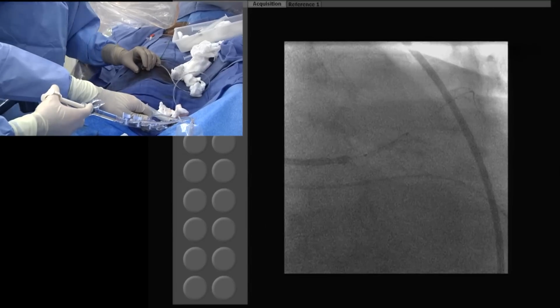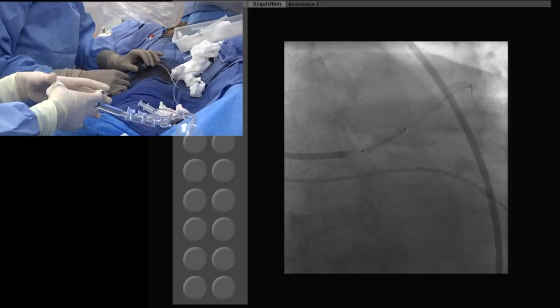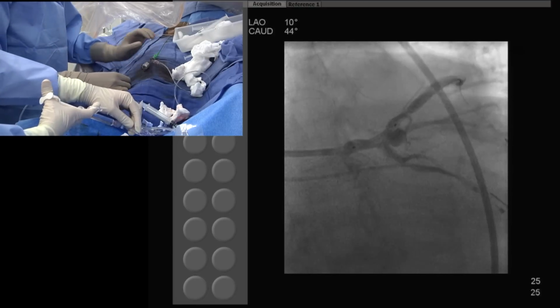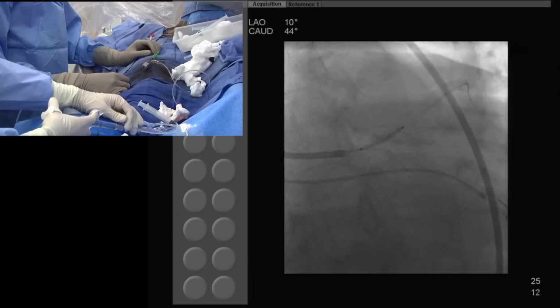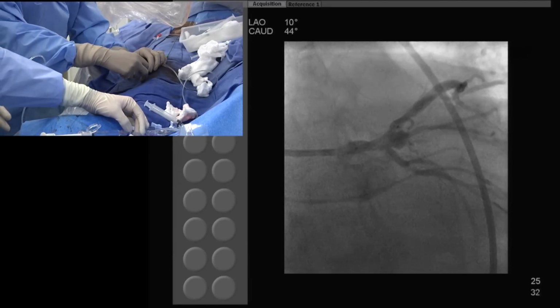Proximally we have to cover. If needed, put an extra 16 stent. Okay in the mid. Good. Covers very nicely. Ready? I think. Wait. Not ready. I want to go in a little bit. No, why? It's too much in the left main. 1 millimeter. That way fine. We are all covered, 2 millimeter. Good. Yeah, 2 millimeter okay.